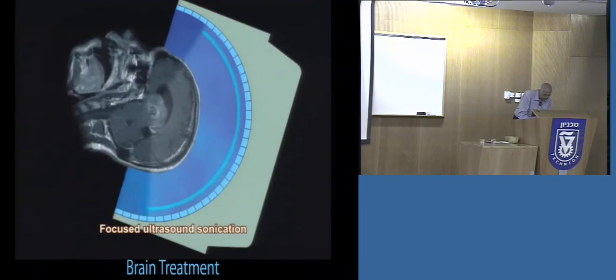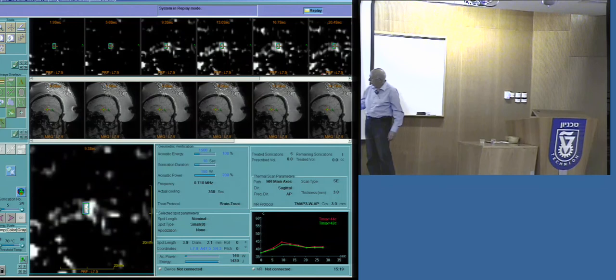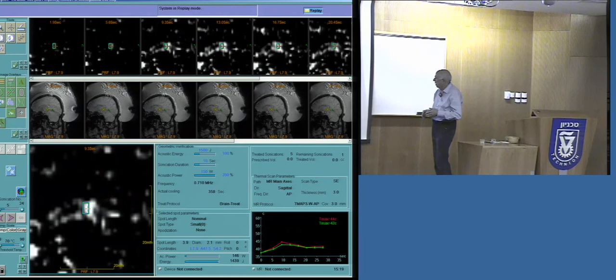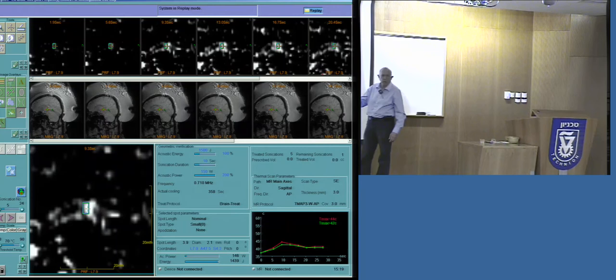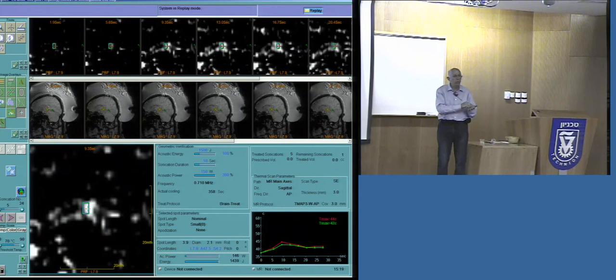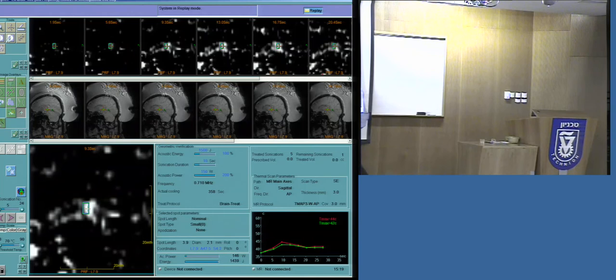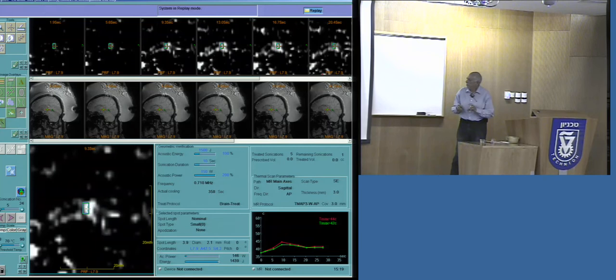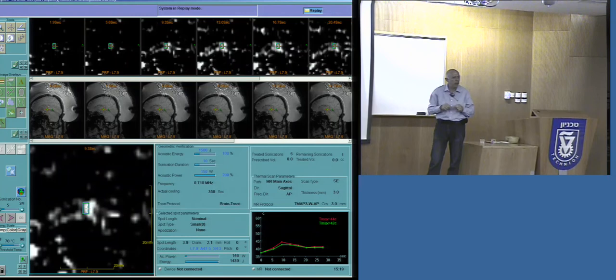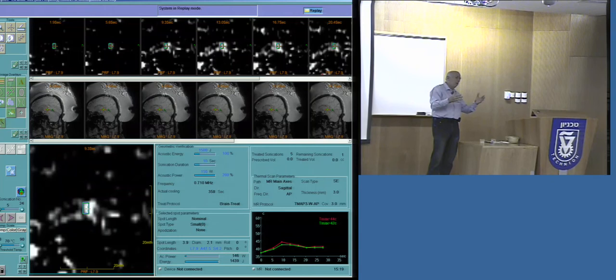This is what we saw from the patient view. This is what the physician sees. He gets slices or strips with MR images. These are the planning images taken once the patient goes into the machine. He selects where the treatment is going to be given. In this case for essential tremor, it's inside the thalamus, an organ in the middle of the brain. To reach there with an electrode like in DBS, deep brain stimulation, you have to cross a lot of healthy tissue. You really need to ablate maybe two millimeters, just a few spots to get the effect. He delineates the area.